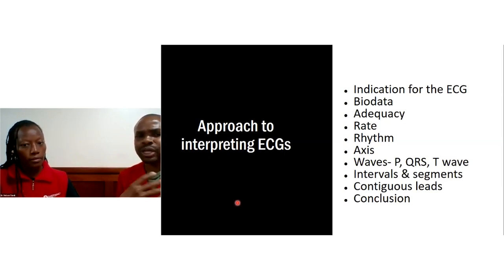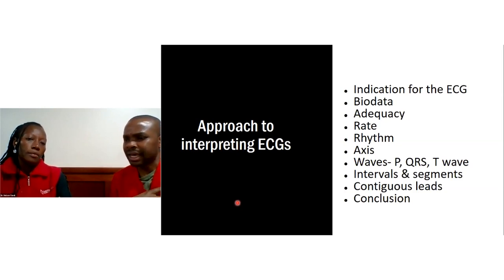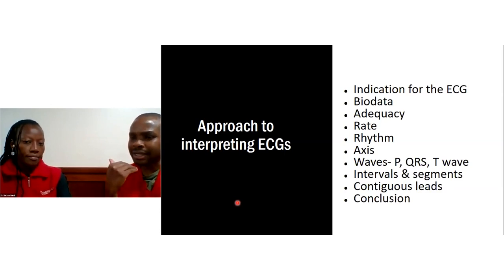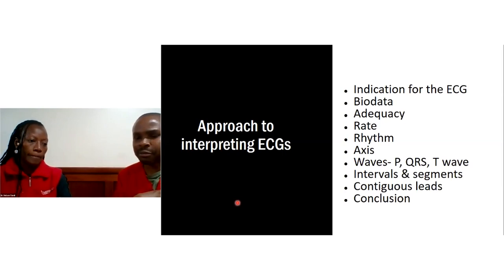I think we are slowly going into an approach to interpreting an ECG, and I was sharing with you, Grace. I work in the ED department, and I'll tell you, ECGs can be very humbling. Very true, I agree. Especially for me, when you bring an ECG, the first instinct is to say, I don't know what's going on, right? But I've come to find that having a systematic approach to an ECG is what safeguards me as a doctor to make sure that I do not overlook something that could be going on in the patient's heart or the electrical conducting system, as it were.